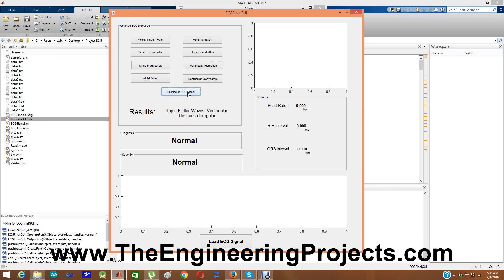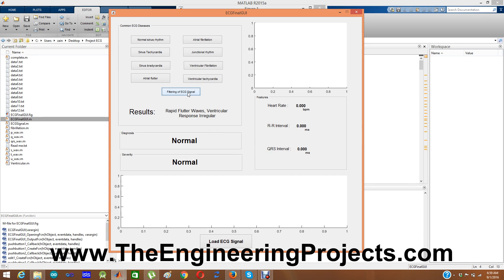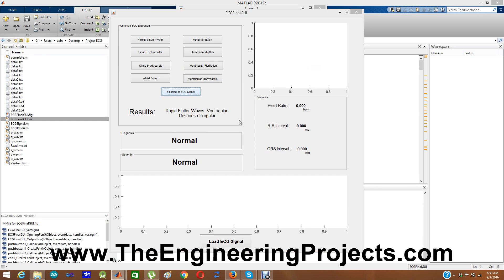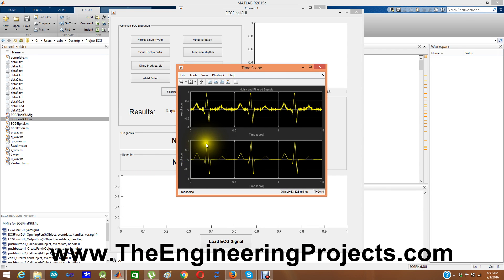Here is the filtering of the ECG signal. I am using a built-in function of MATLAB and I have normalized and removed noise from the ECG signal. The normal ECG signal has a lot of noise in it, which you can see here — this is the noisy signal and here we have a simple noise-free filtered ECG signal, a simple waveform. I have designed this simple function to show you how you can filter an ECG signal.